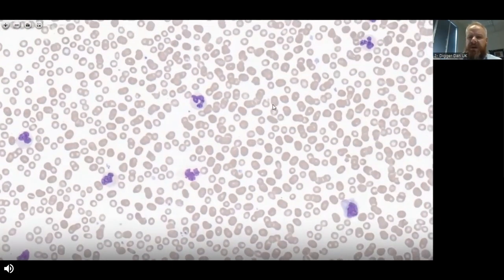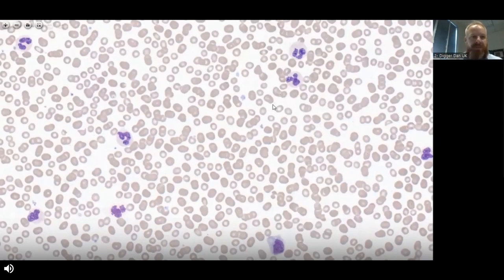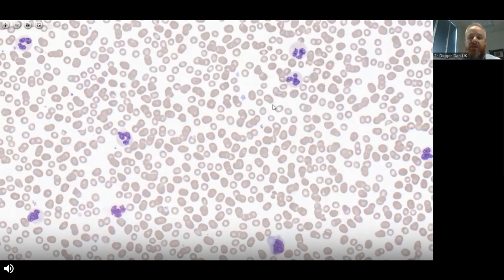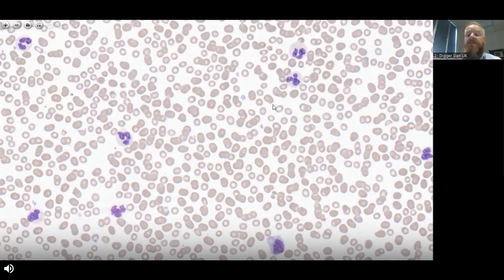What actually causes platelet clumping? Patients do not have platelet clumps circulating in vivo — platelet clumping is an in vitro phenomenon. More often than not it's mediated by the presence of EDTA, the common anticoagulant used for full blood counts. The anticoagulant causes a conformational change in the glycoprotein receptors on the surface of the platelets — specifically the glycoprotein 2b3a receptor — which causes the platelets to become slightly activated and to start clumping together.